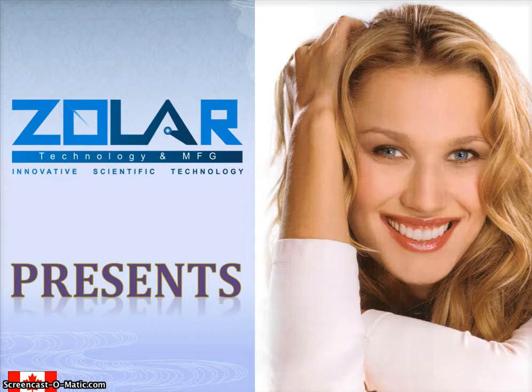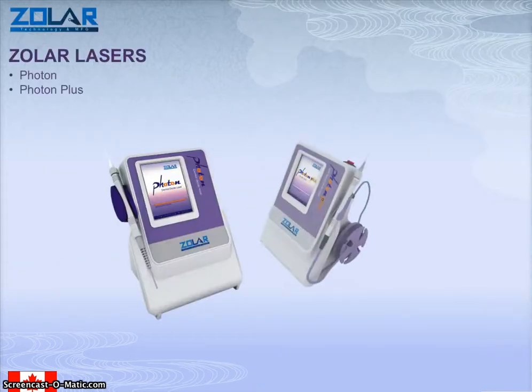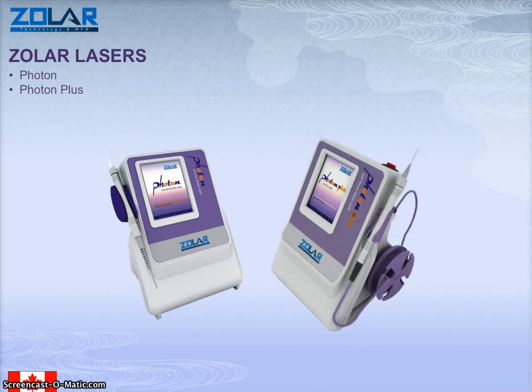Welcome to Elexadent, which is the dealer for Zolar technology. This is basically a presentation for our dental laser from Zolar. This is a Canadian manufactured device. It comes in two models: the Photon and the Photon Plus, and I'll explain the difference between the two as we go along.